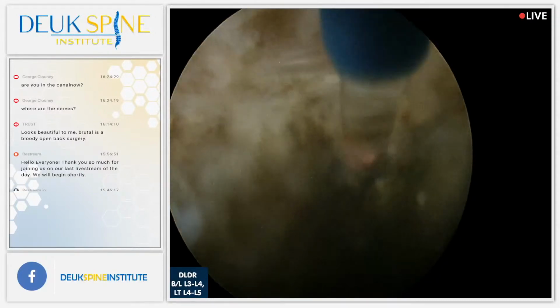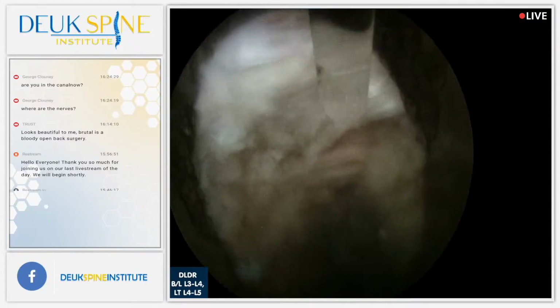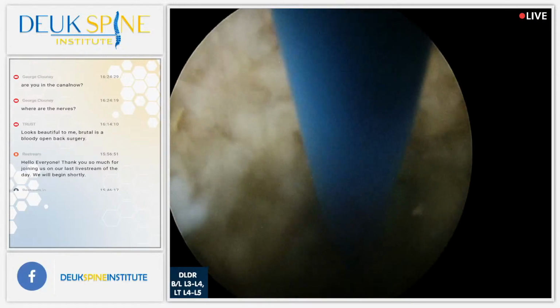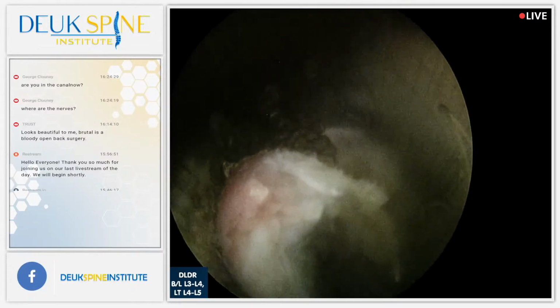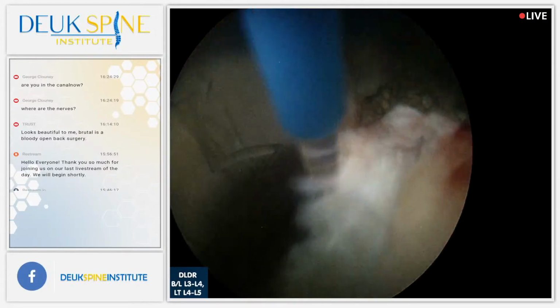But Yoda is Dr. Anthony Young. Dr. Young is, of all the endoscopic surgeons for the lower back, not for the neck, the one with the most experience in the world that I know of. He's done more cases than me. There's your nerve, by the way, right out there in the foramen. You can't even see it. I'm going to use the laser to clean this up.